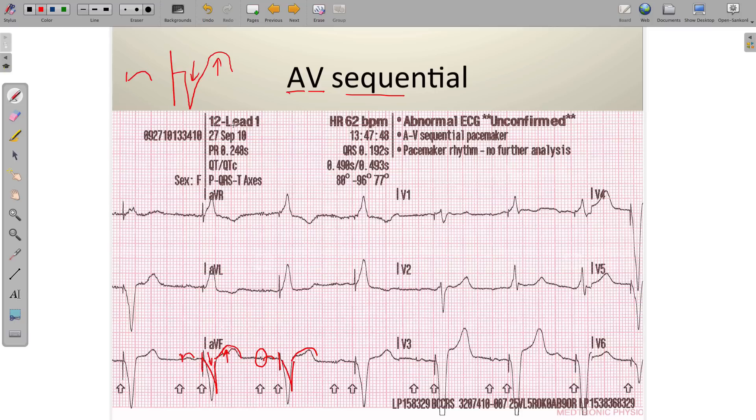The AV sequential pacemaker takes atrial characteristics and ventricular paced characteristics and puts them together, and you'll be able to see that on the EKG itself. This little spike is the atrial pacemaker firing, and this larger spike is the one responsible for ventricular stimulation. Then we get this negatively deflected QRS complex and positively deflected T wave — that is the discordance.